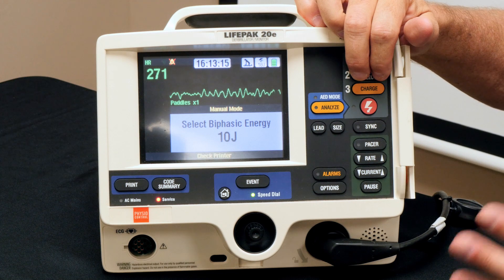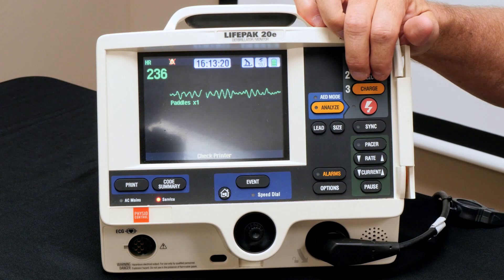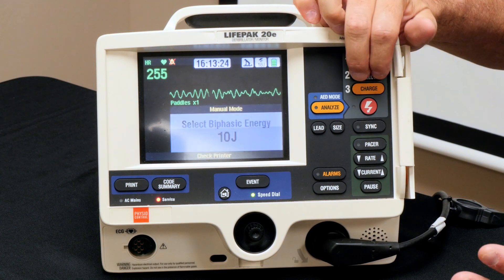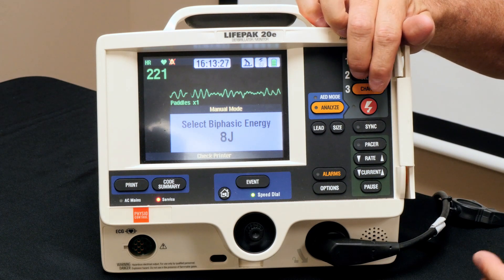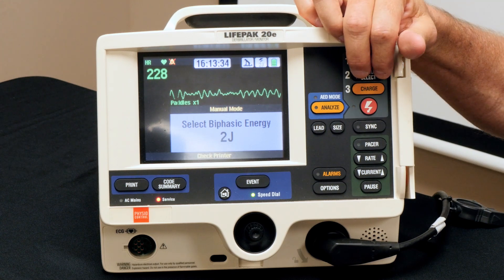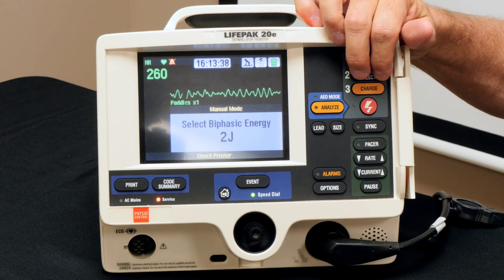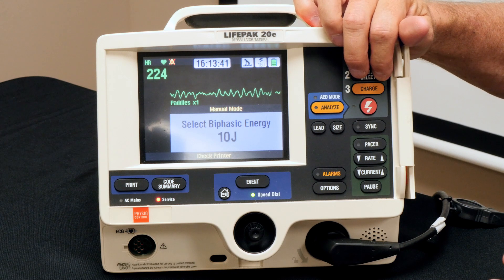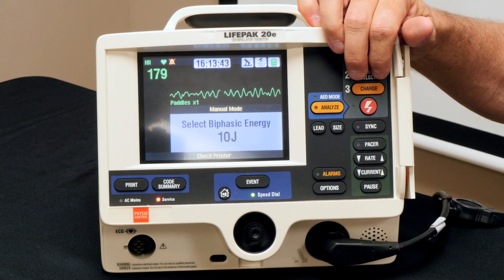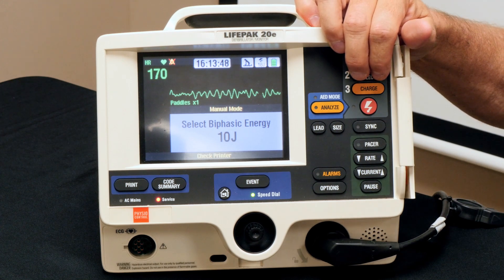It's incredibly rare, but you may actually have to shock a newborn. So the defibrillator goes down to 10, 9, 8, 7, 6, 5, 4, 3, 2 — some go all the way to one, just like a NASA shuttle launch countdown all the way down to one.